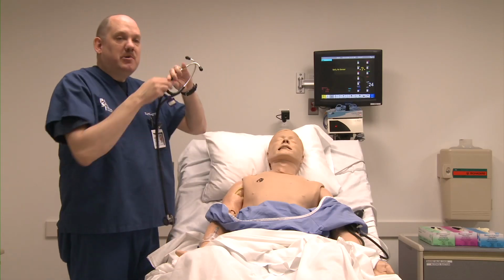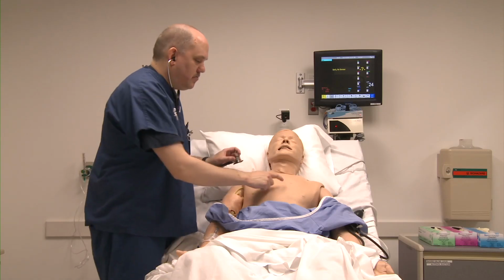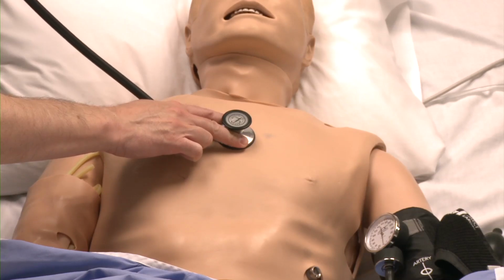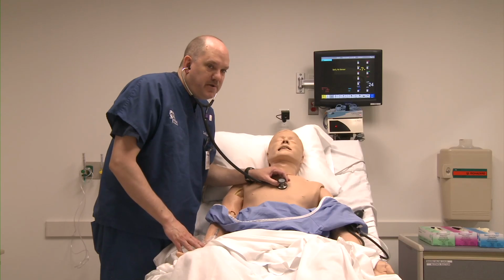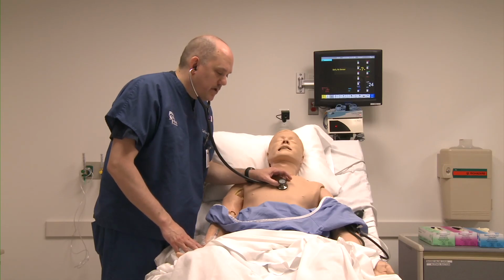To listen to the apical heart rate, we need to put the diaphragm of our stethoscope right in the center of SimMan's chest. Now, this is not where you would expect to find an apical heart rate on a living human being, but this is where you need to put the diaphragm on the simulator. If you put it in the center of the chest and listen for a moment or two, you should be able to hear the patient's apical heart rate.